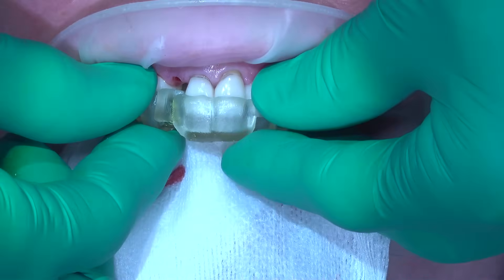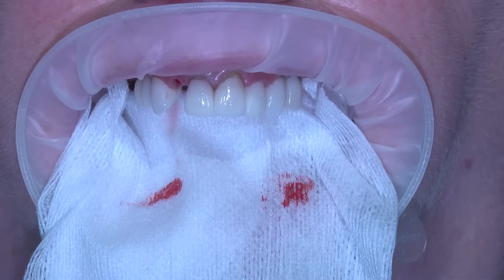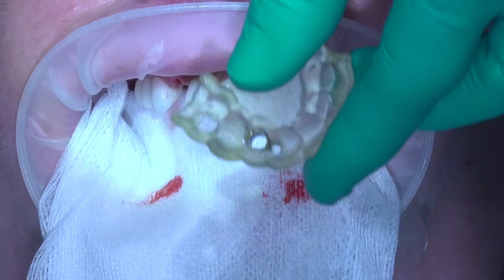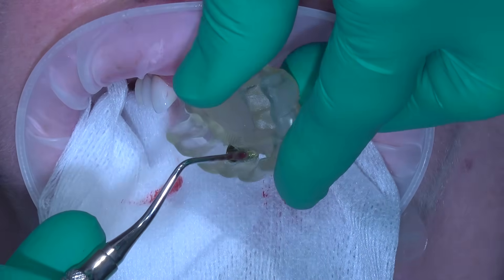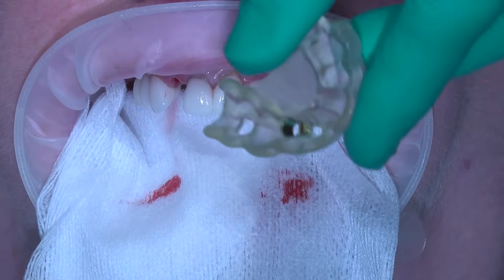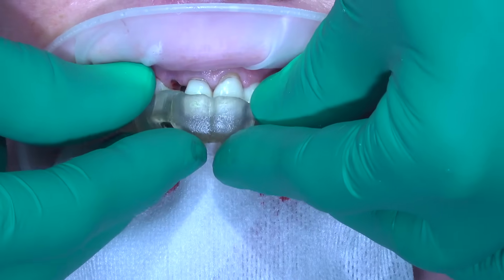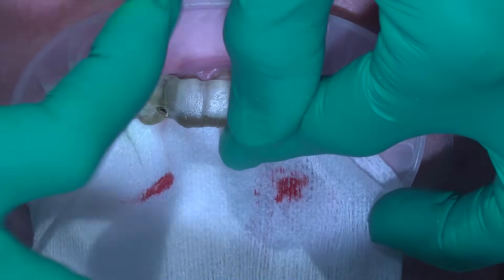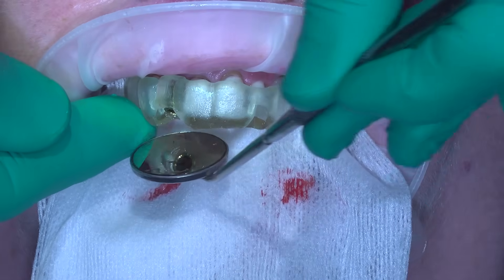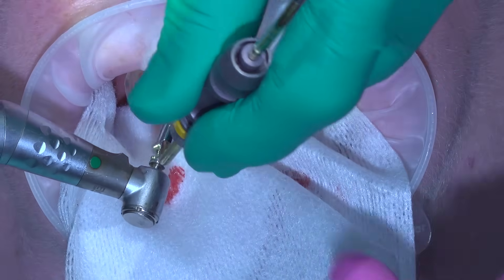Now the surgical guide does not fit, and the reason it doesn't fit is we're placing a lateral. The lateral is the smallest tooth in the upper maxilla, and therefore the master cylinder is engaging the teeth on either side — the interproximal teeth. So all I do is take it to the back table, adjust it with a diamond burr, make it a little thinner, and then it seats just fine. We have to do that routinely because the master cylinders have a tendency to engage teeth either on the mesial or distal.